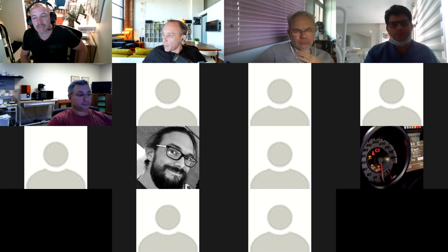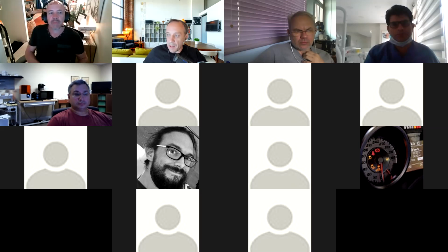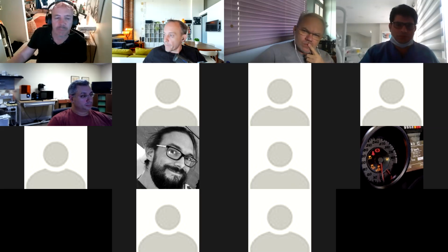Good, nice. Right. All right. Are there any other suggestions that we might want to introduce into the module? Have you recorded the session so we can share? Yes, I have. I've recorded the session. Yeah, I think we've covered a lot. We've covered the gum. You can use that for all on fours, for example, if you want to have some gum there. So there's quite a lot we can do.